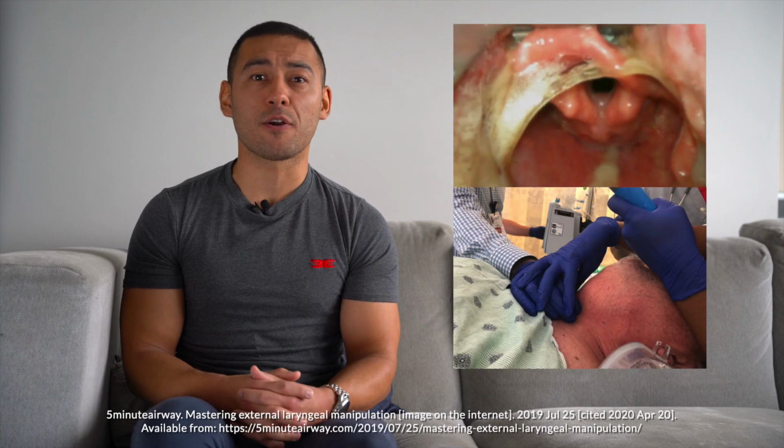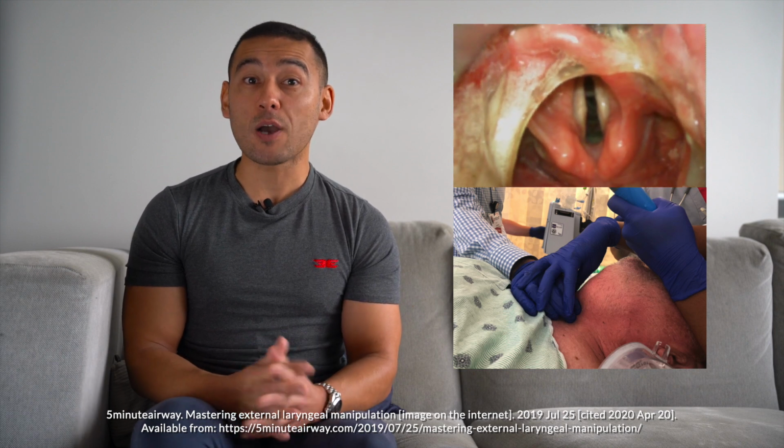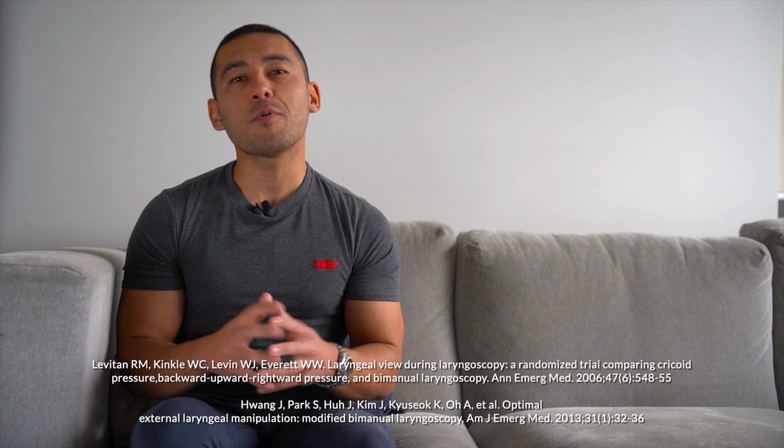Despite some evidence suggesting it can also improve laryngeal view, its use remains controversial. And number 3 is bimanual laryngoscopy. The modified version involves an assistant placing the hand on the patient's thyroid cartilage. The intubator then guides the assistant's hand until the best view is achieved. Evidence demonstrates that bimanual laryngoscopy is the most effective method at improving laryngeal view.